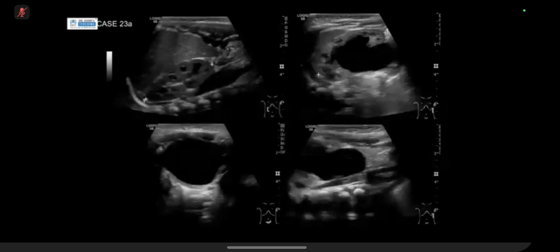So what question do we have when we see kidneys with a PUJ obstruction? What do we want to know? Yeah, so we would like to do the cross-sectional imaging to know the causes, for example, any obstructing vessels or bands. Okay, so that's a potential thing. What about for nuclear medicine? What do we want to know from the nuclear medicine study? So we can appreciate the function of the cortex and the split function. And what else do we need to know?